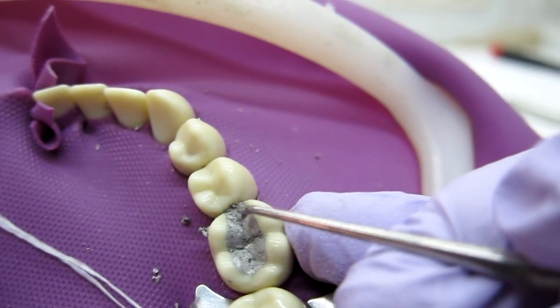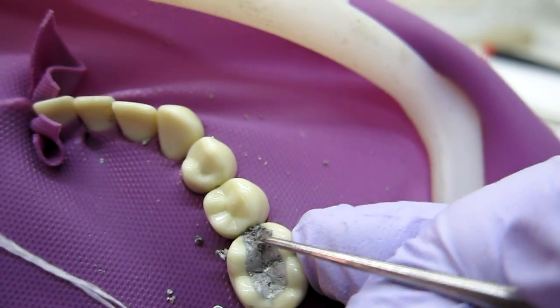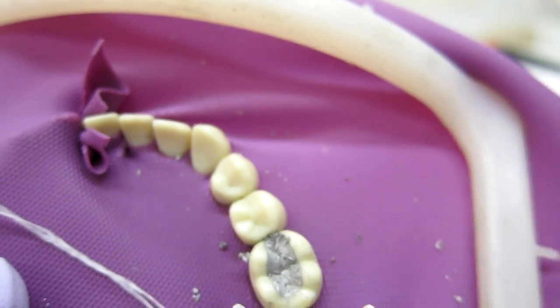The last part is to make sure all of your occlusal anatomy is good. If you need to go back and define any of the grooves, go ahead and do that with whatever instrument you need.